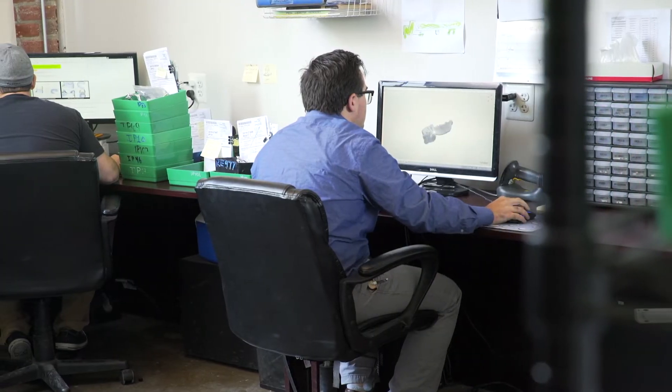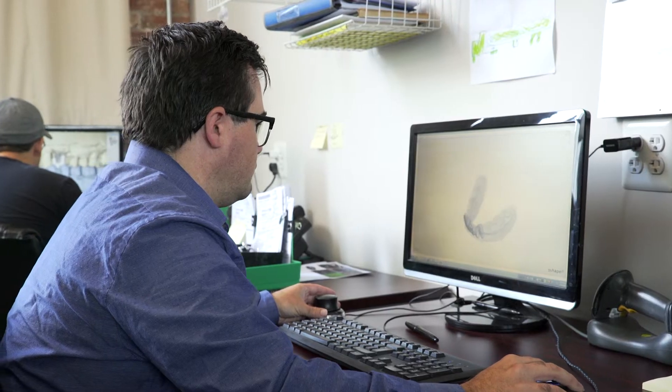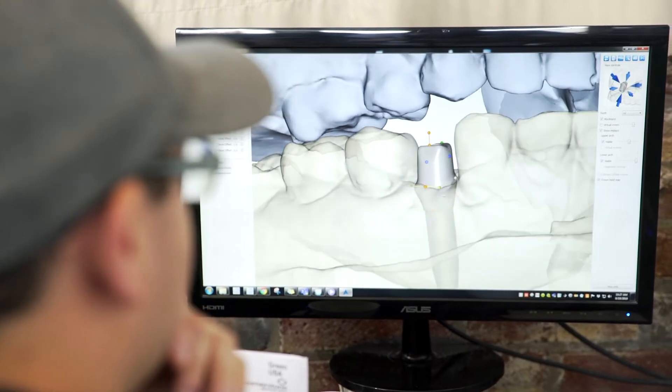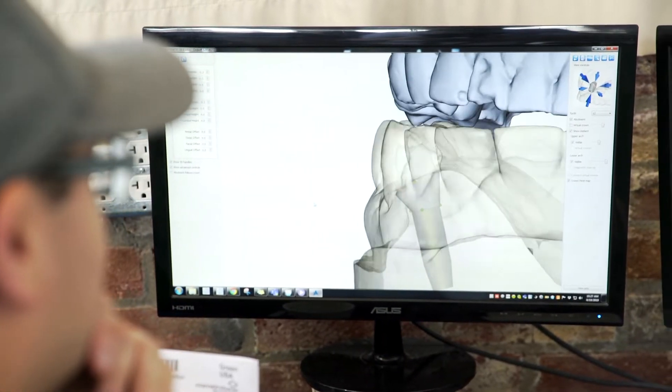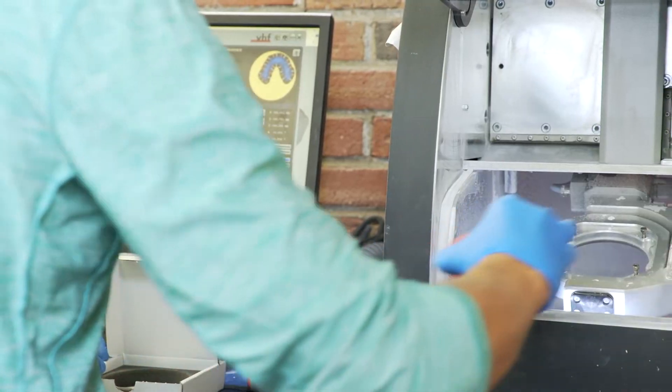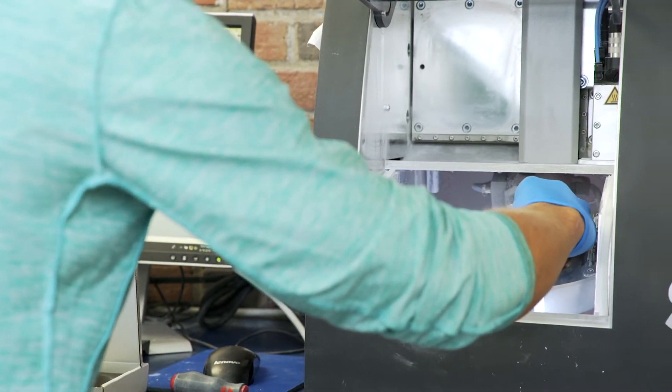The process starts on the computer, where a digital design team creates the template for a perfect denture. Using CAD, a designer will create the digital image for the final denture. The files are imported to the mill, where the machine begins forming the Key Mill Denture Base Disc into the denture.